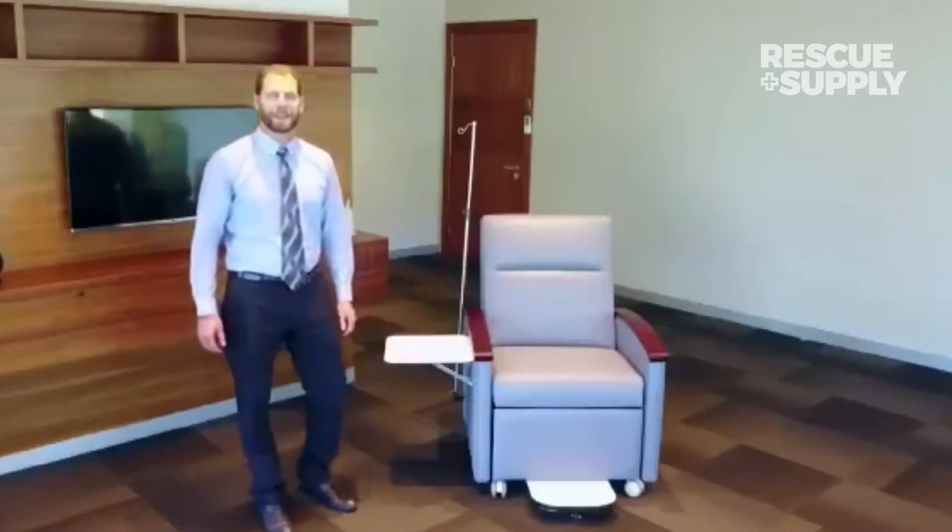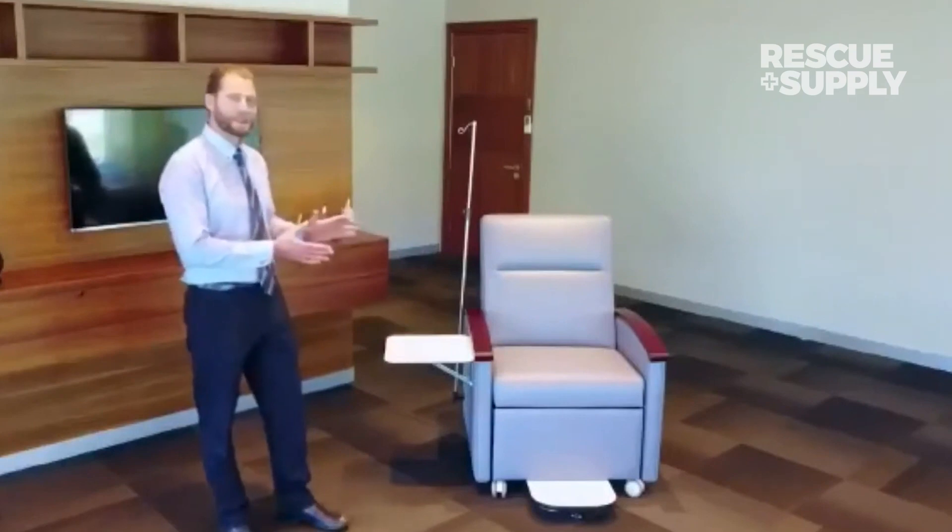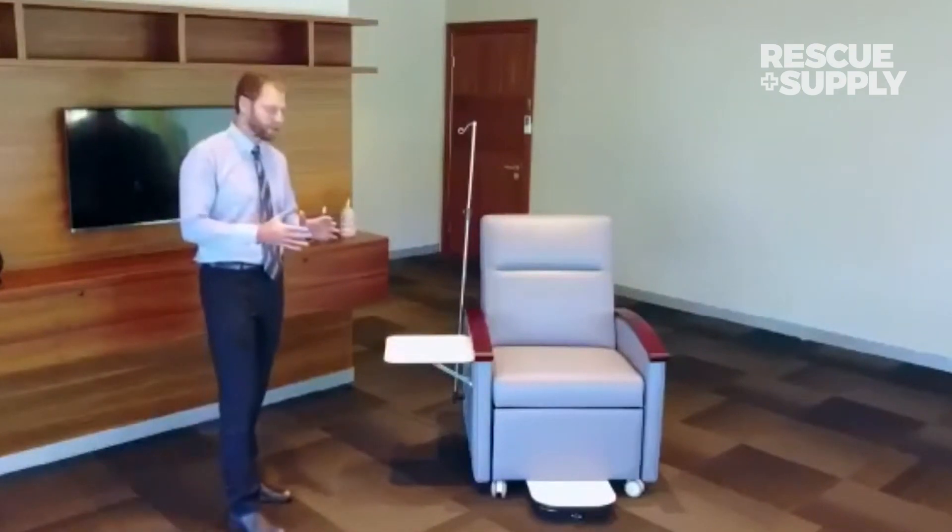Hello, Jonathan Powell here with H&T Medical showing you the 6000 series recliner. This is our 2018 model and it has many features that I want to showcase.